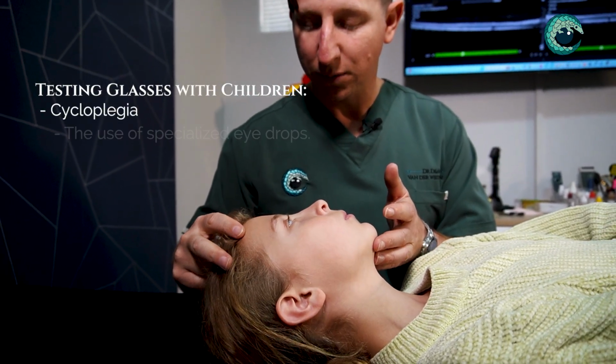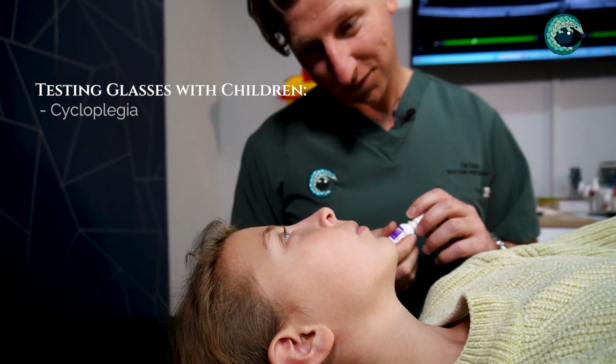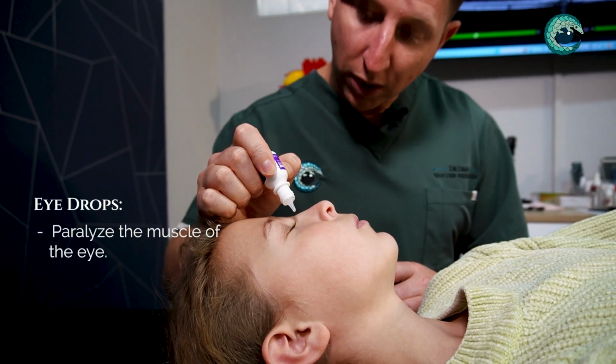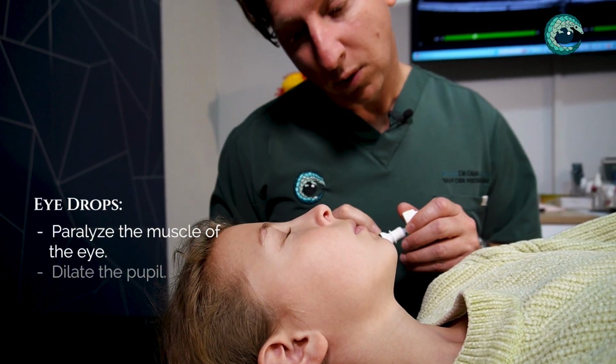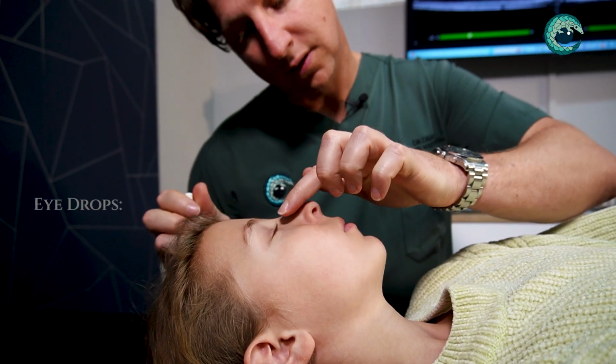What that means is we give eye drops. There are a few different types of drops that can be used. Often they have a red top, but not always. Essentially those eye drops paralyze the muscles of the eye and dilate the pupil. And we want both. By paralyzing the muscle around the eye that changes focus from far to near, the eye's focus isn't changing the whole time, which means when you're doing a reading or an assessment, their glasses script isn't changing the whole time. So that's really useful. The other thing is, with the pupil open, it's easy for us to do retinoscopy.